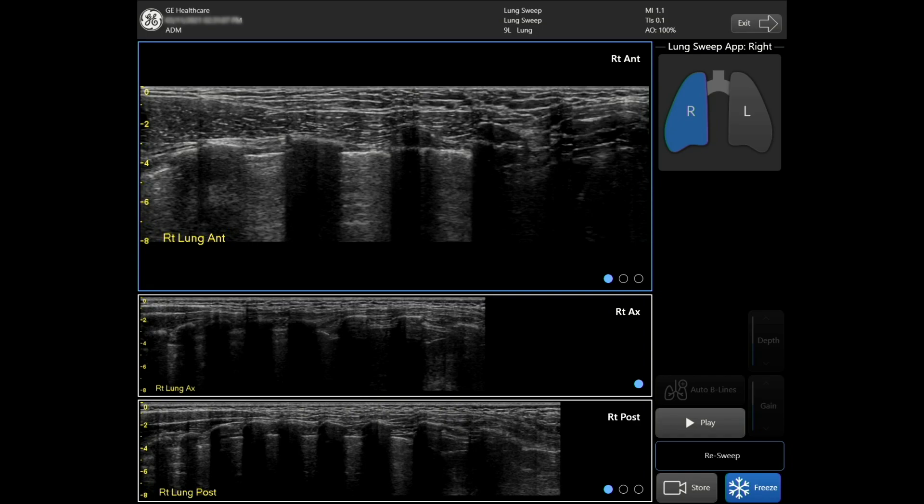This tool is automatically activated at the start of each sweep when the probe is tapped on the body, and deactivated at the end of each sweep when the probe is lifted. There is no need to touch the screen.